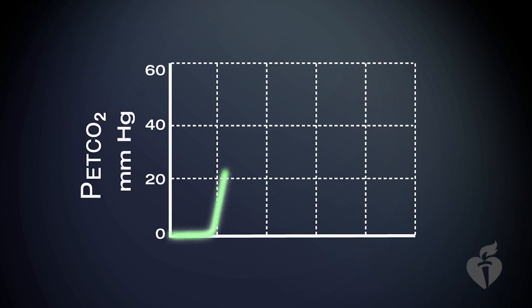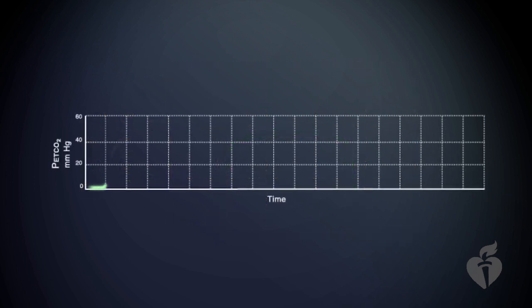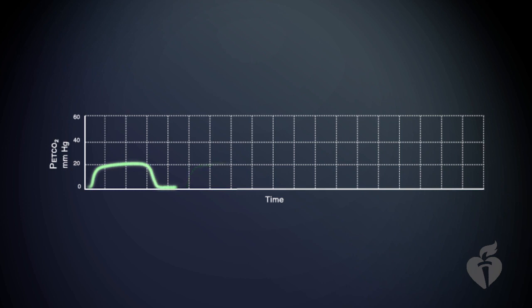The measurement of the amount of end-tidal, or exhaled, carbon dioxide can be shown as a waveform, where the carbon dioxide level goes up when we exhale and falls back to 0 when we inhale. Even when healthcare providers are properly ventilating the patient, chest compressions will produce a low end-tidal CO2 reading because even the best CPR produces cardiac output and pulmonary blood flow that's about 25 to 30% of normal. In contrast, ROSC can cause an abrupt increase in end-tidal CO2. Waveform capnography devices that display both a waveform and a number will give you the most comprehensive information.